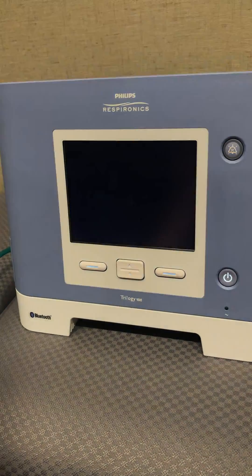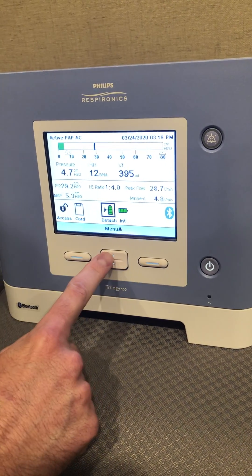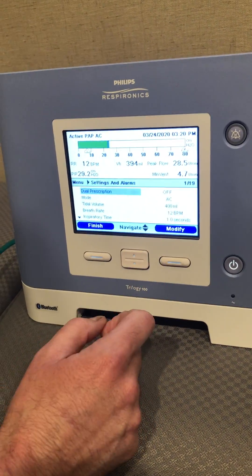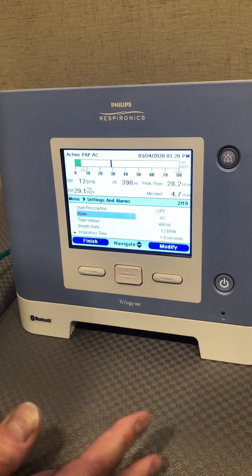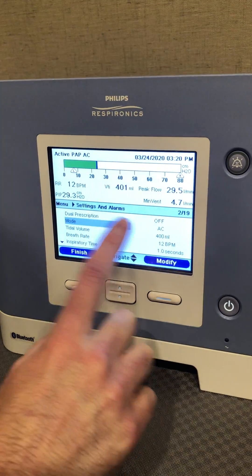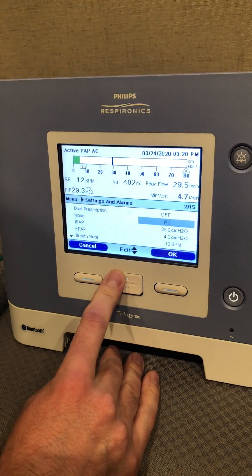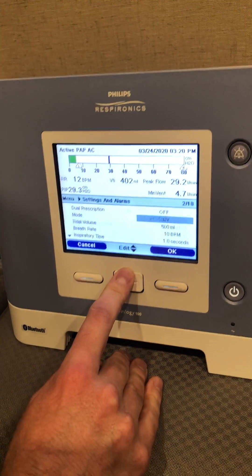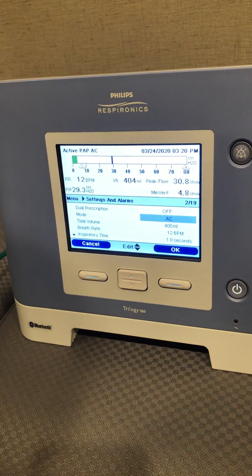Now I want to go into the menu and scroll down to Settings and Alarms, hit Select, then go to Mode. It's currently on Assist Control. Since we're doing an invasive setup, I want to use a common mode for invasive patients. I am going to use Assist Control, but just so you know, we can also use modes like SIMV, Pressure Control Ventilation, and SIMV with Pressure Control Ventilation.